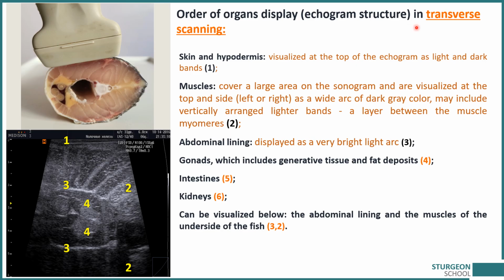Structure of the sonogram in the transverse scanning. Transverse scanning is a diagnostic mode in which the transducer is placed on the body perpendicular to the axis of the body. In this case we see a different location of the organs.